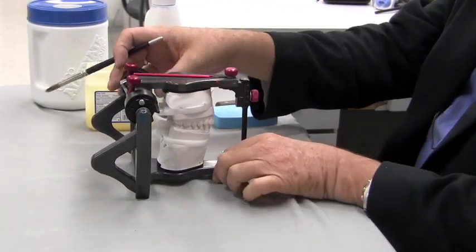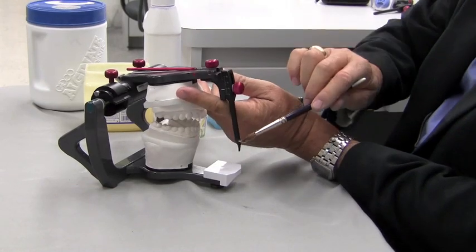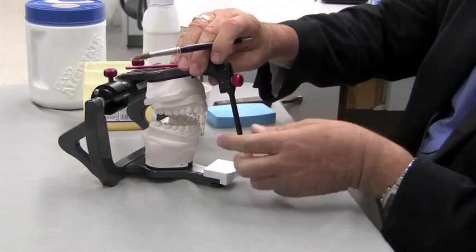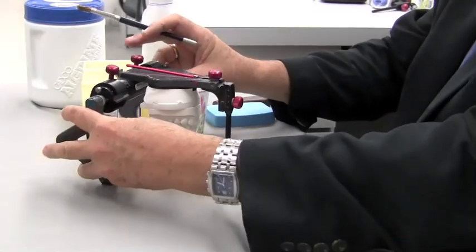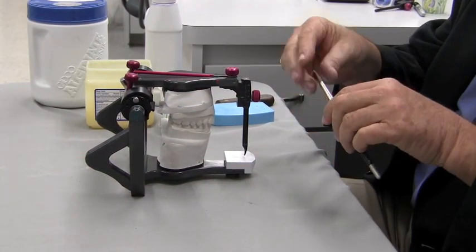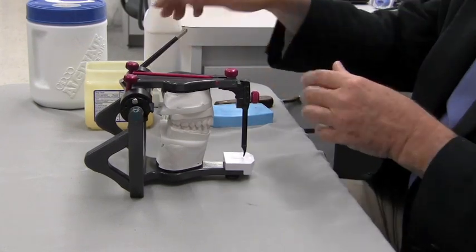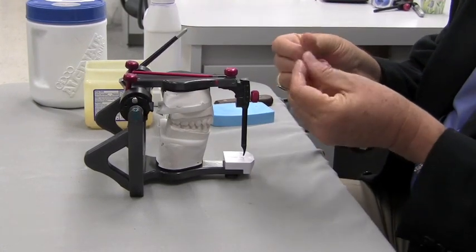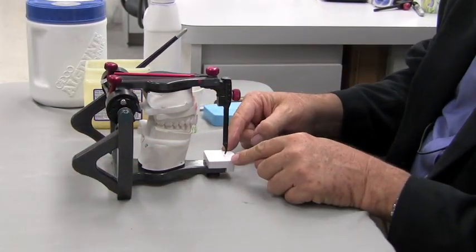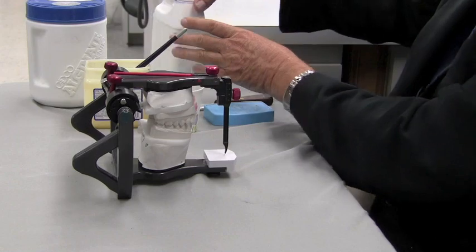We also do not want any acrylic to stick to our pin, so I'm going to put some Vaseline on the pin down here and wipe that clean. I'm also going to use this brush to put a little bit of Vaseline on my fingers so the acrylic doesn't stick to me either. What I don't want to put Vaseline on is this guide table, because I do want the acrylic to stick there.